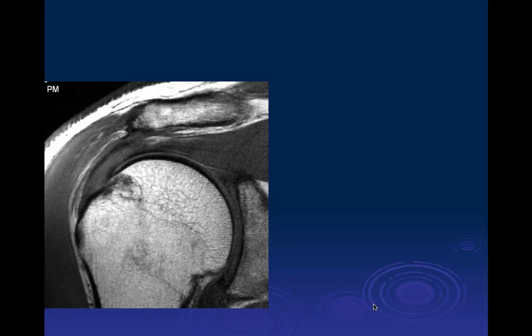Deshali, what do you think of this case? Okay, so you have a coronal T1 image, and the supraspinatus tendon demonstrates some increased or intermediate T1 signal intensity, and then in the mid aspect, at approximately the 12 o'clock position, there's some almost fat signal intensity within the tendon at the myotendinous junction. And you can certainly see that at the musculotendinous junction. The inferior surface looks intact, but again, we can see some traction bone injury here of the subcortical trabecular bone near the footprint.